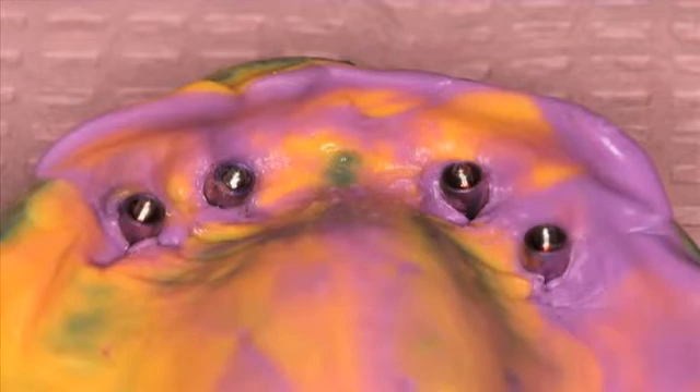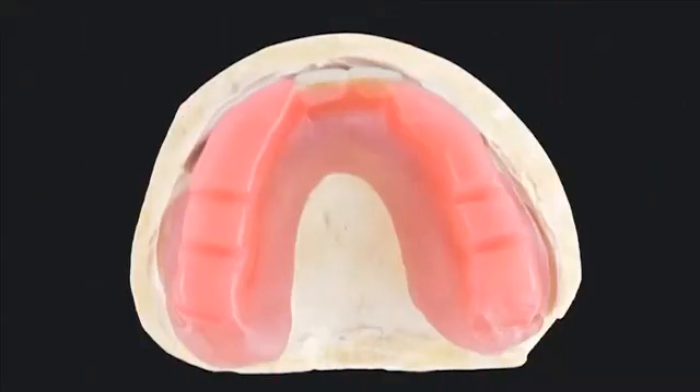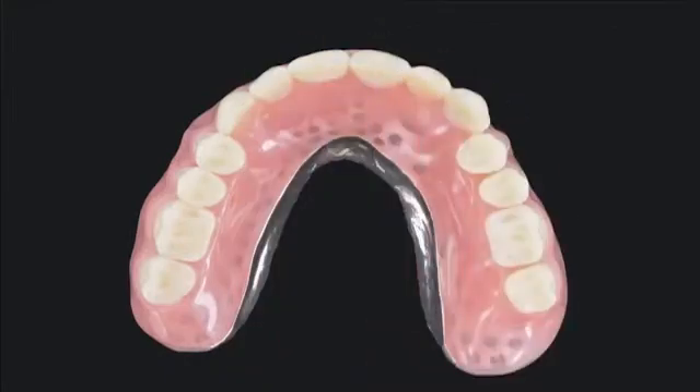Quality impressions provide for an accurate master cast. Your dental laboratory will require quality final impressions. The dental lab — in this situation, Glidewell Lab — fabricates stable record bases and occlusal rims, and we do our conventional denture fabrication. Conventional denture techniques are used to create an aesthetic denture, so we do try-ins and make sure that the patient is happy with the results while in wax.